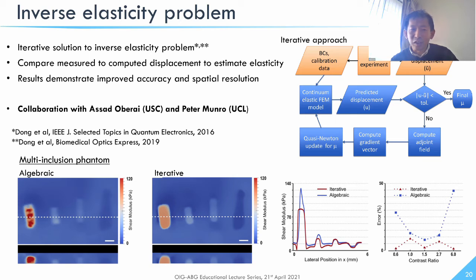Well, yeah, that's actually a great answer in the sense that it leads to the second question, which is that you've shown, well, not necessarily live in vivo elastography, but sort of excised on the procedure operation table. So if you think about it, would it be possible to conduct this in vivo? And if it does, would blood flow in a live tissue complicate the readout?